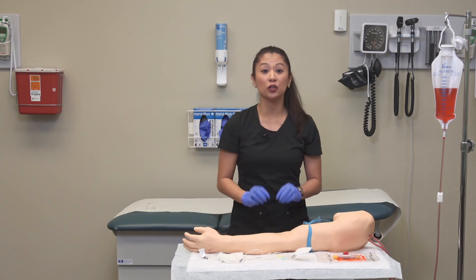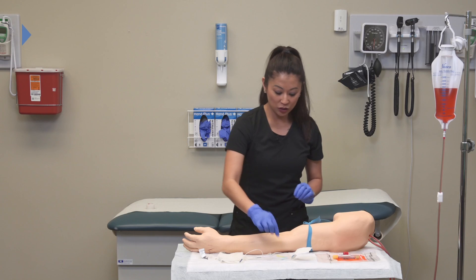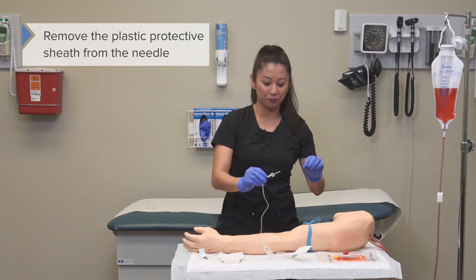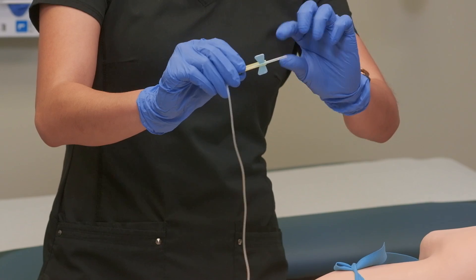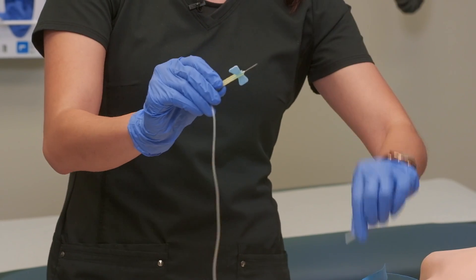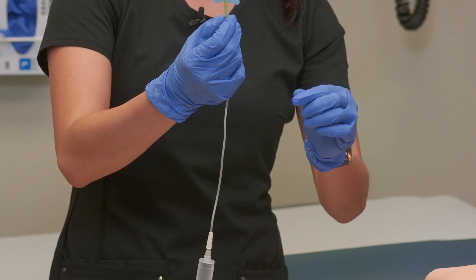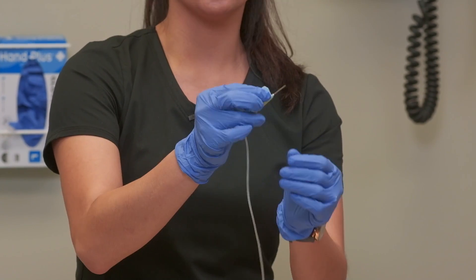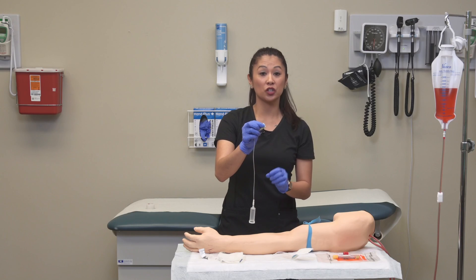It's important to let the alcohol dry. Once that's done, we can remove the plastic protective sheath from the needle — pull straight out. These needles have little wing devices that I like to hold onto for the insertion of the needle.